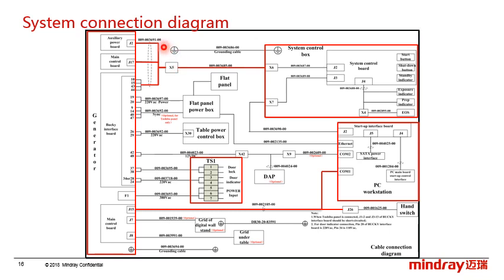And like the S file, it comes from the generator to the system control box, used to control the system power on or off and provide the emergency function and exposure indicators.